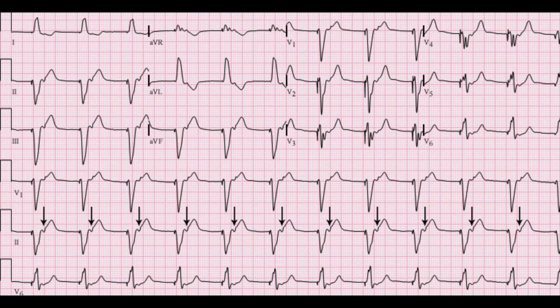Before diving right into this, I must stress that what is considered technically an abnormal ECG may be entirely normal for the patient in question. For example, the ECG of a patient who has a pacemaker is technically not normal, although the patient may have been living with a paced heart for years. Also, there are normal variants. ECGs may appear abnormal, but they are indeed normal in the patient-specific context.